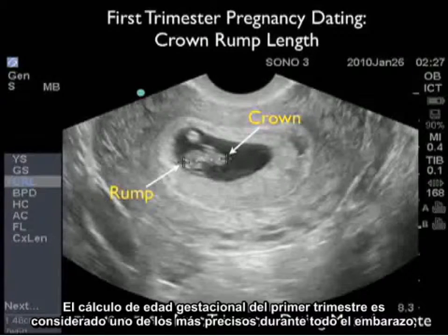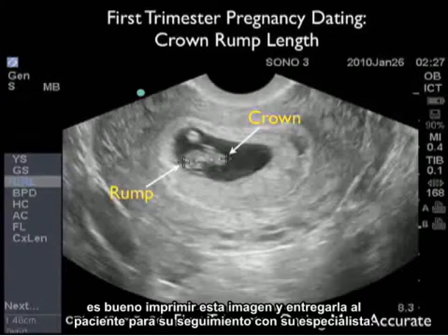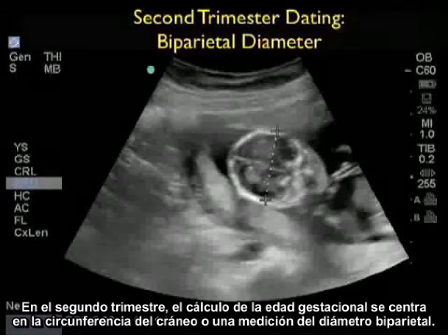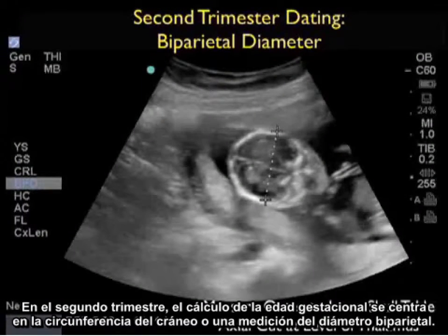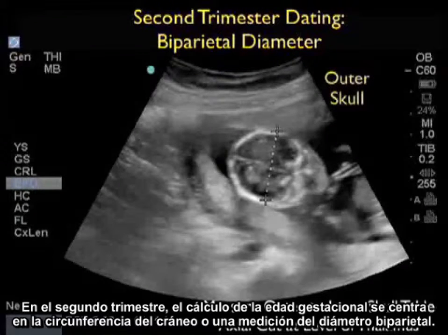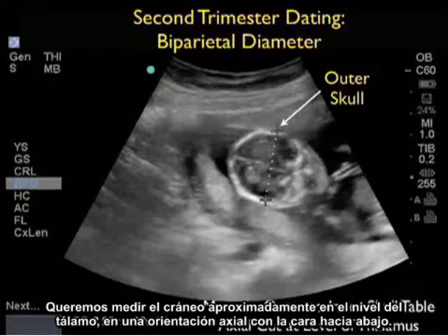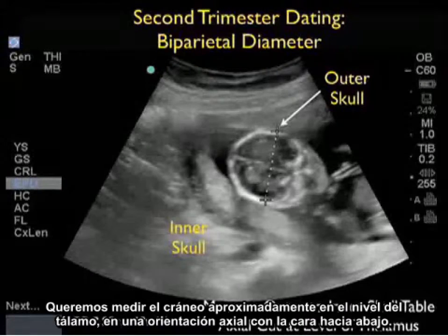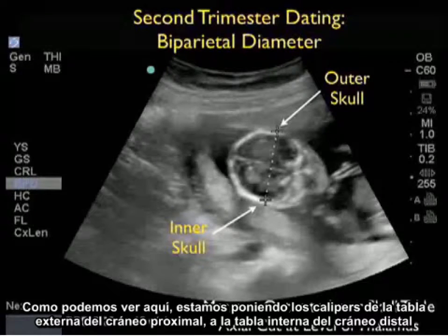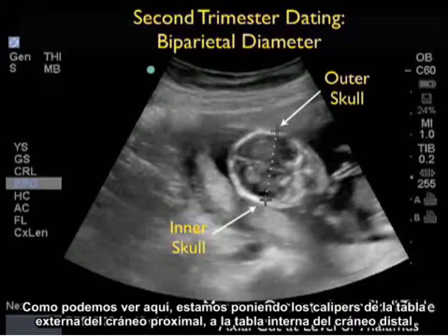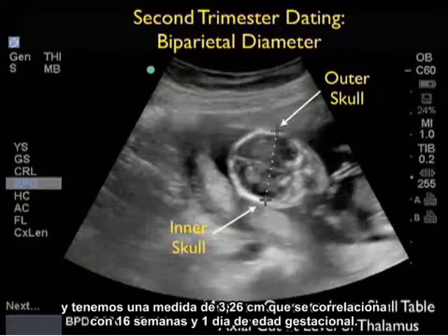Seven weeks and six days. As first trimester dating is considered one of the most accurate during the entire pregnancy, it's nice to print this image out and give to your patient to take for their follow-up visit with their OB-GYN. In the second trimester, dating of gestational age focuses on skull circumference, or measurement of the biparietal diameter. We measure the skull at about the level of the thalamus in an axial orientation with the face down. We're placing the calipers from the outer skull table proximally to the inner skull table distally, and we get a measurement of 3.26 centimeters, correlating to a 16-week, 1-day gestational age.